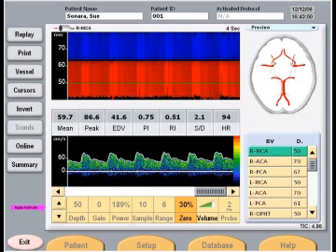But M mode gives us so much more information. M mode shows where there is flow. So anywhere that we have color filling, we will get a Doppler signal. In this situation, I can see that the M mode for the MCA, flow towards the transducer, is in red. We're going to be able to get flow all the way down to about 42 and all the way to about 64. And then right about 64 should be our MCA-ACA bifurcation. And it shows us that we have a patent ACA also from depths of about 64 to 80.